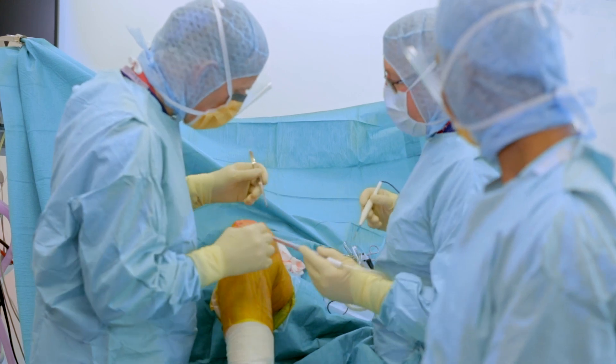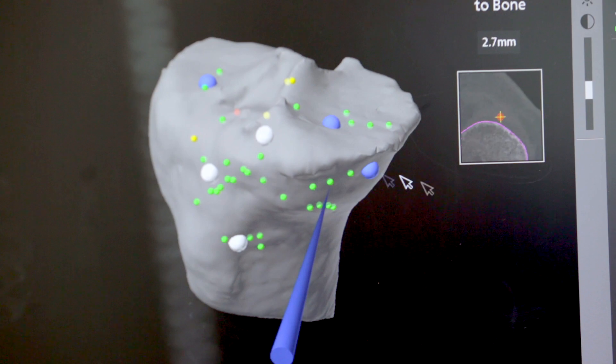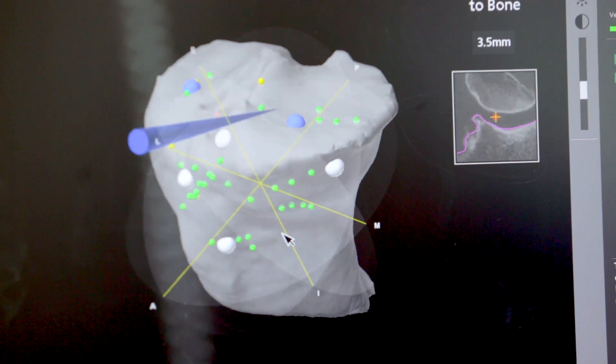Planning is one of the most important things we do in any operation. We need to know how bad the knee is at the start and what we are trying to achieve — where we are trying to put the knee replacement so it's absolutely right for that patient. The first step is the creation of a three-dimensional model of the patient's knee using a CT scan, which is a very complicated X-ray that allows us to slice the knee up into many thin slices and get a very accurate picture of the size and where the wear is within the knee.